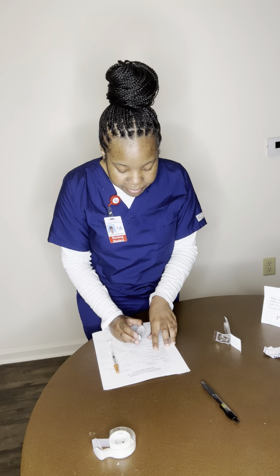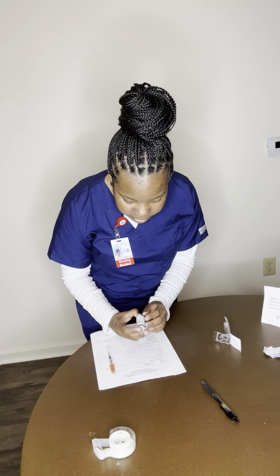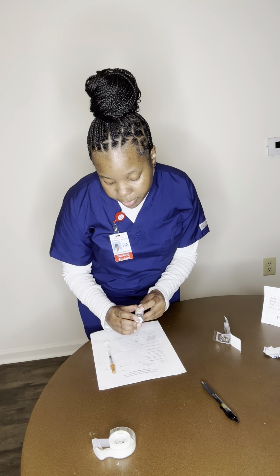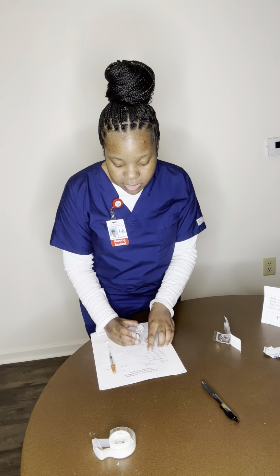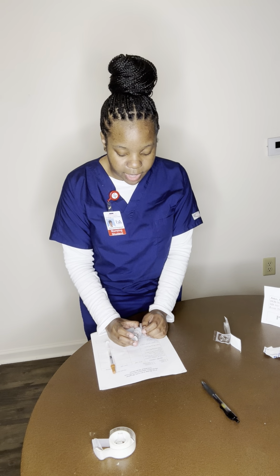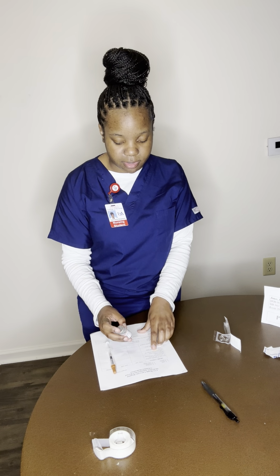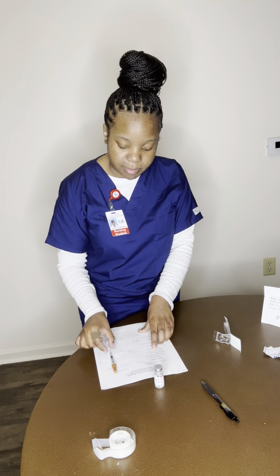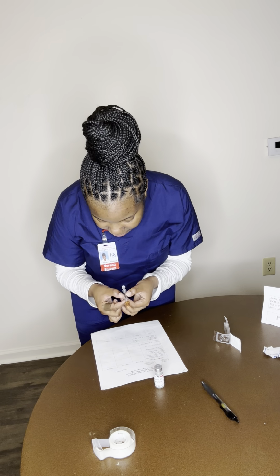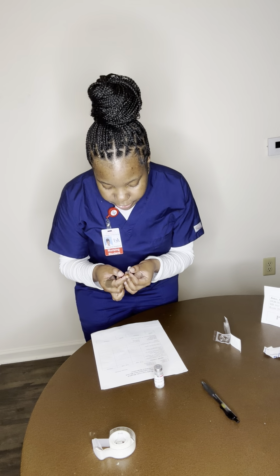So we have heparin 5,000 units subcutaneously every 12 hours, and we know that this is heparin 10,000 units per 1 milliliter. So we know that 5,000 units is half of 10,000 units, and half of 1 milliliter would be 0.5 milliliters. So in my syringe, I do have 0.5 milliliters.